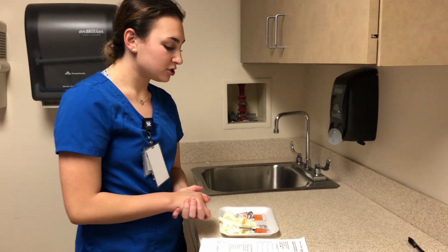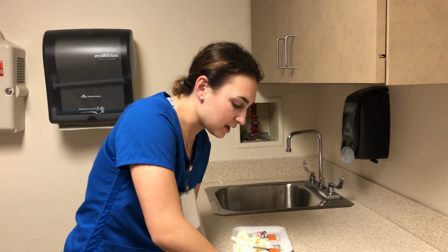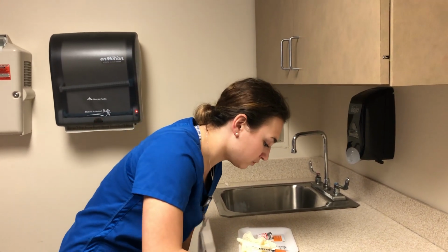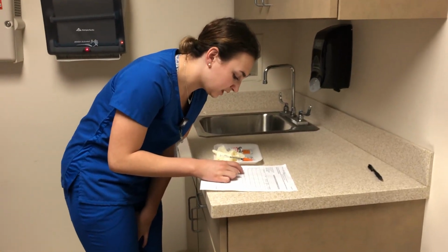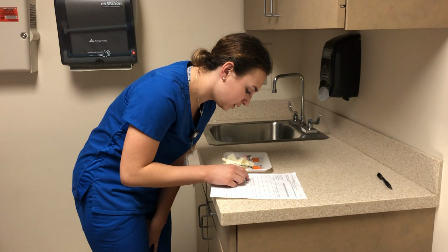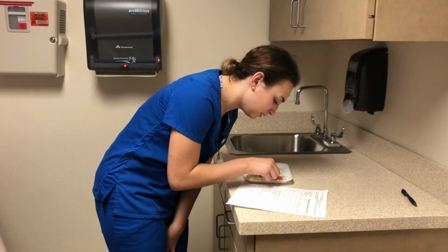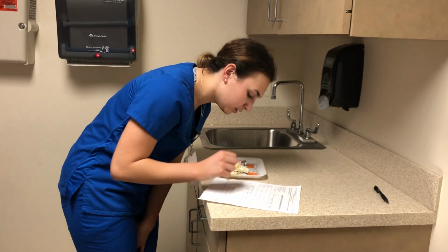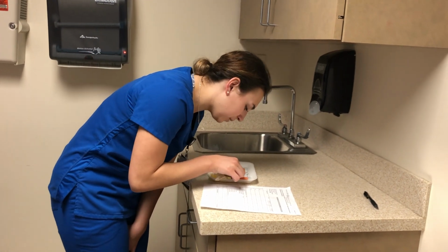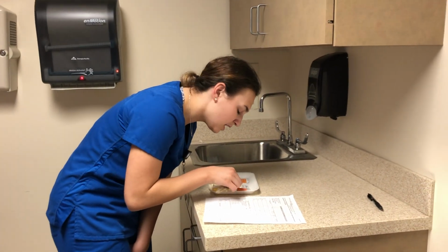Today we're going to be administering regular insulin, so that should not be an issue. Today's date is February 10th of 2020. I am administering a PRN medication, which is Novolin regular insulin. It is 100 units per 1 milliliter, which is what I have prepared here. I have 6 units prepared in my syringe, and I'm just double checking that one more time.